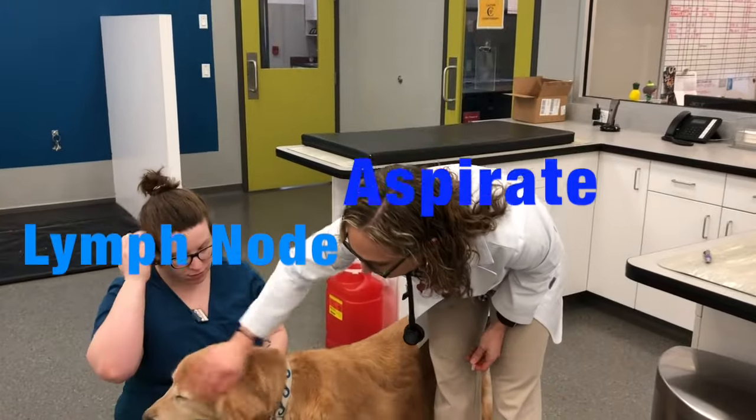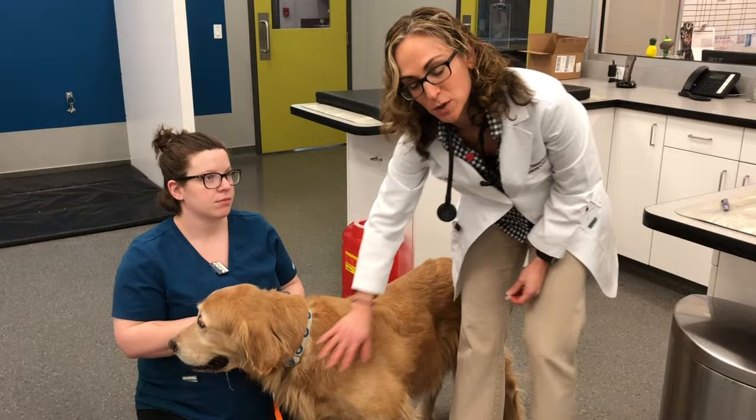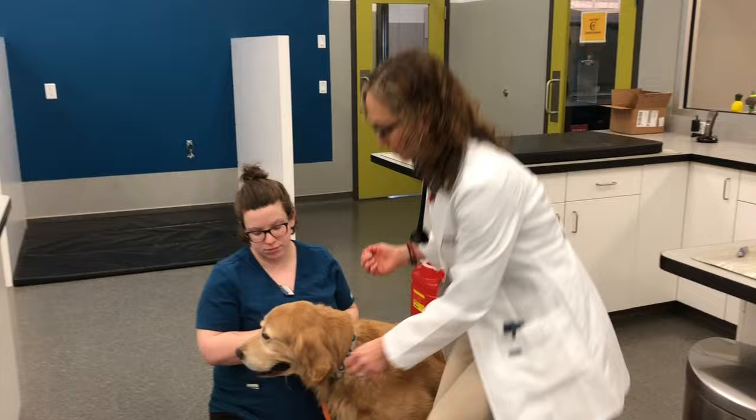Ranger is a suspect lymphoma patient and we are going to re-aspirate his lymph nodes. I will usually not aspirate the mandibular lymph nodes if other ones are enlarged — I'll do the prescapular or the popliteal — but these are the only ones enlarged with him, so we are going to do that one. He's drooling a little.